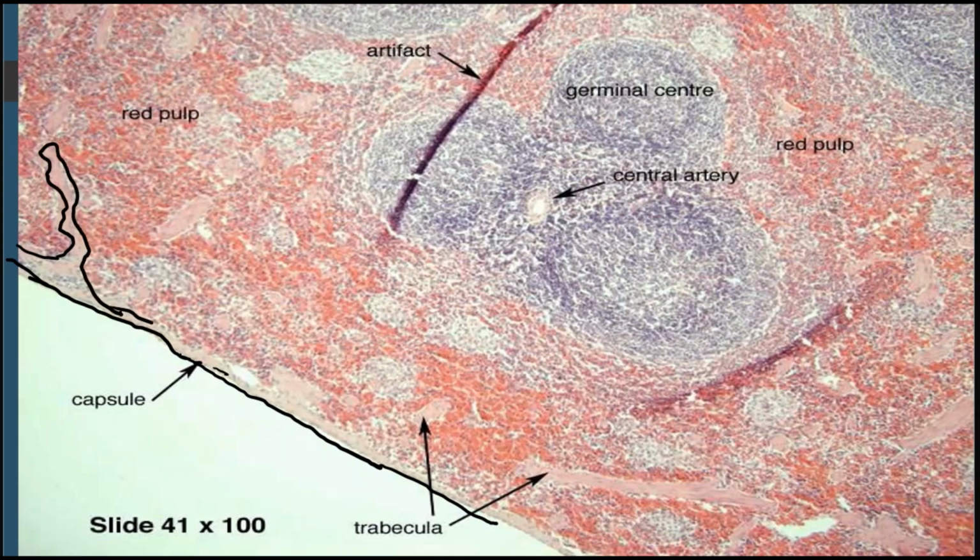These are what we call trabeculae. So that is a trabecula. This is the trabecula also here in longitudinal section, and this is also the trabecula in cross section.